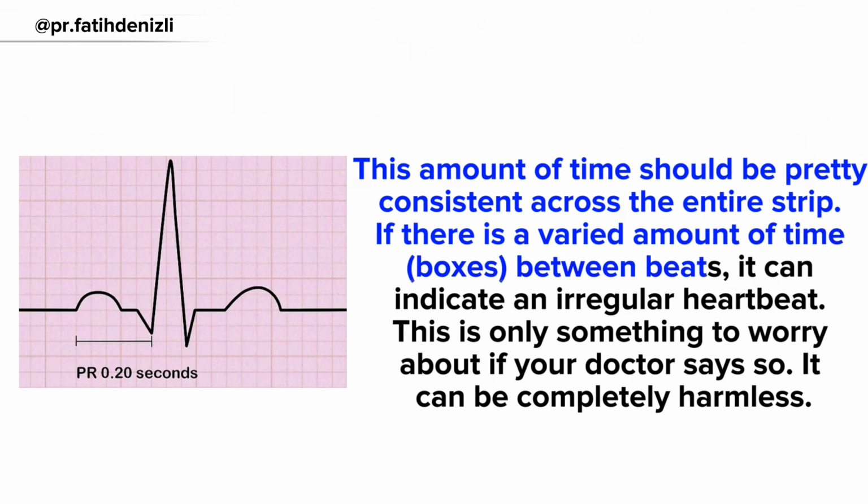If there is a varied amount of time or boxes between beats, it can indicate an irregular heartbeat. This is only something to worry about if your doctor says so. It can be completely harmless.